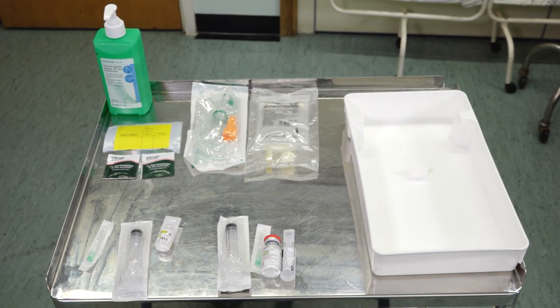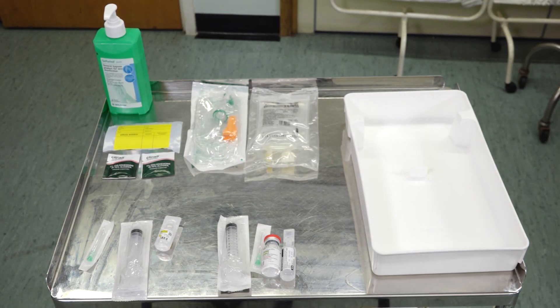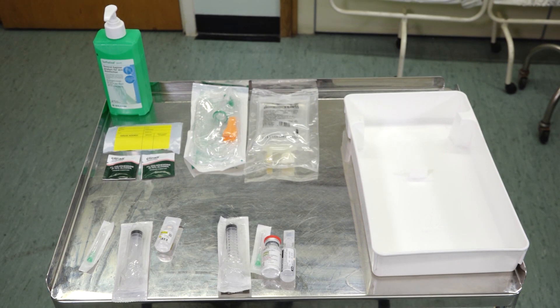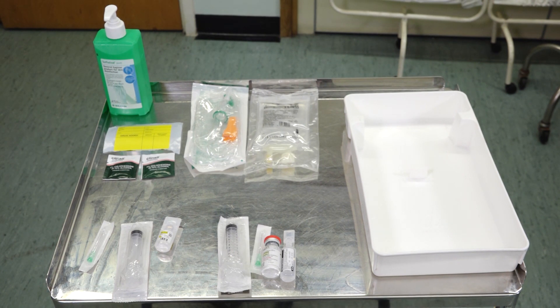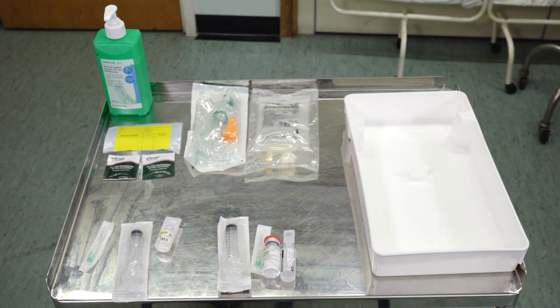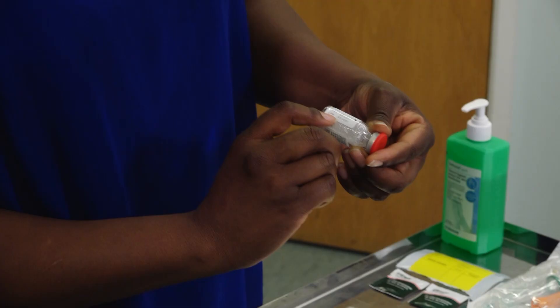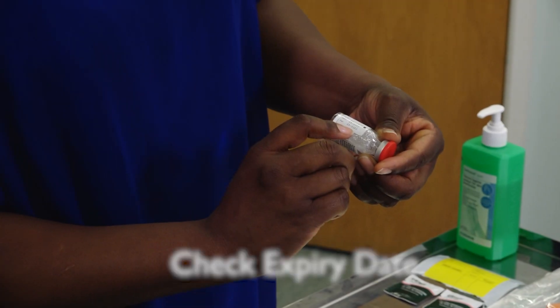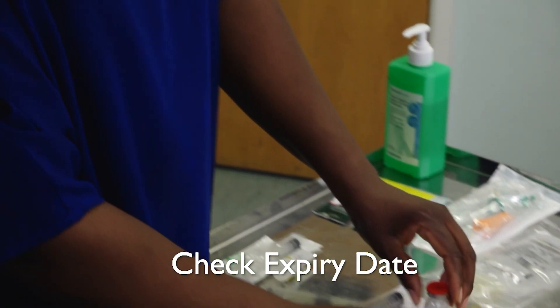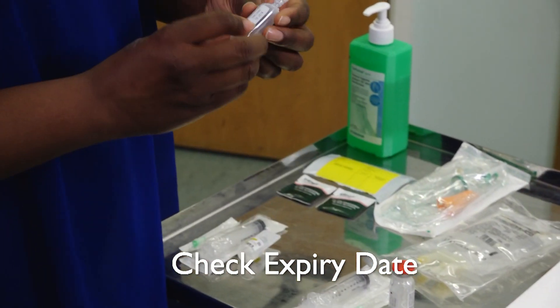Clean a dressing trolley with an alcohol wipe. Clean a plastic tray, first on the inside and then on the outside. Gather the equipment and check their expiry dates as you go along.